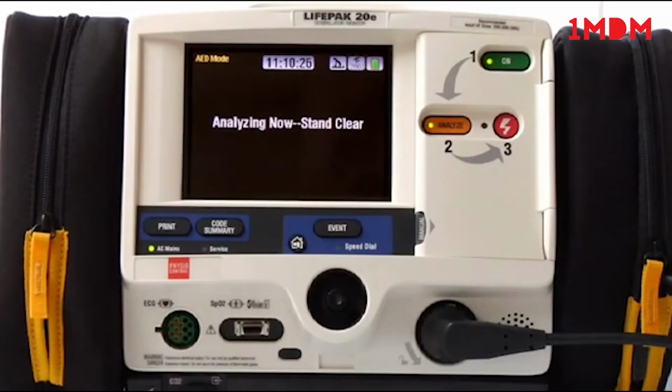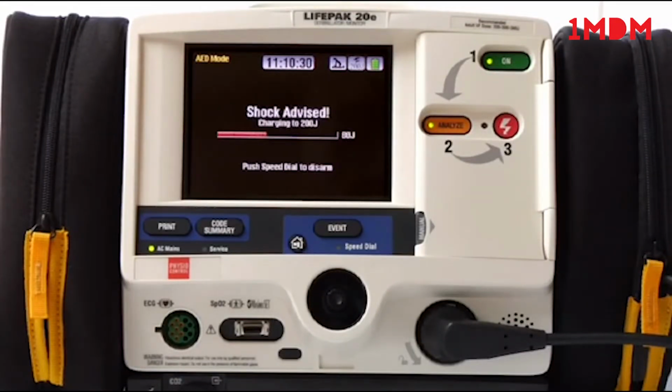Analyzing now. Stand clear. Shock advised. Stand clear. Push to shock.